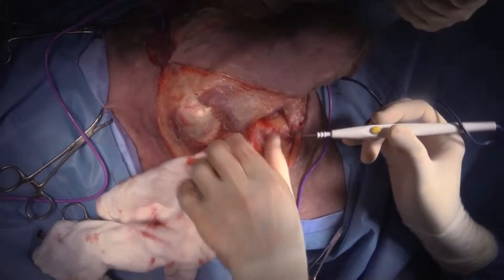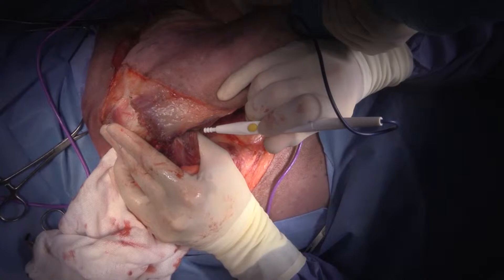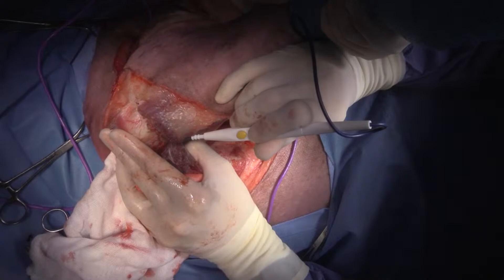Just getting to the end of the pectoral muscle here. Can we get some silk, please? I think we might have some out on the table already.